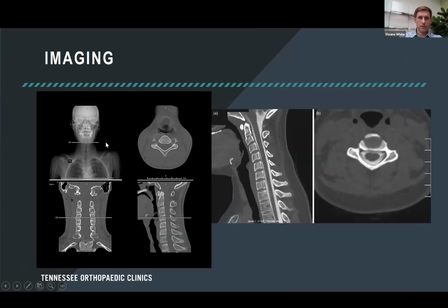Here's an example of a CT scan on the left and a CT scan with contrast on the right. On the left, you have very excellent detail of the bony structures, but as you can see between the bones, you can't really make out the neural elements, which is what the dye is for, which will highlight the spinal cord as well as the nerve roots, and the dye is the white appearing substance surrounding the ovoid spinal cord.